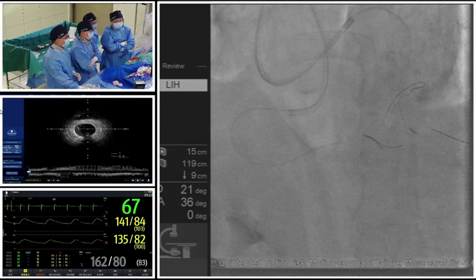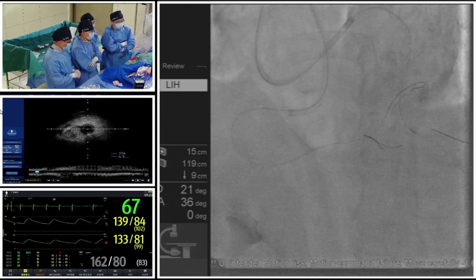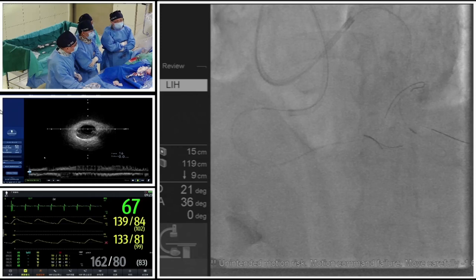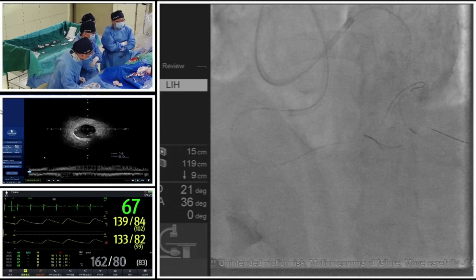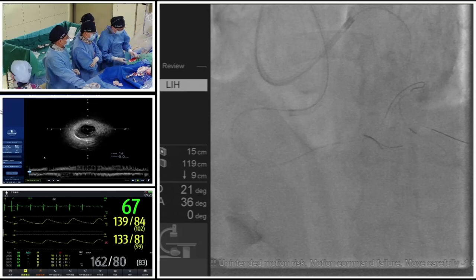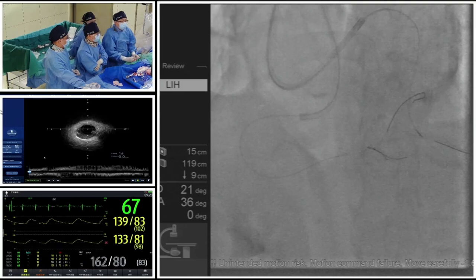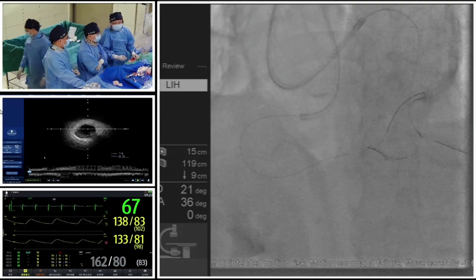If the bifurcation zone, especially the POC segment of the distal bifurcation, is ambiguous and there is no clear landing zone, and we put a stent at the distal bifurcation, we may take a great risk of losing a very big side branch, for example the PLV or something. This is not a good choice because it harms the prognosis of the patient. So I think this is key information. Let me check the distal bifurcation site.